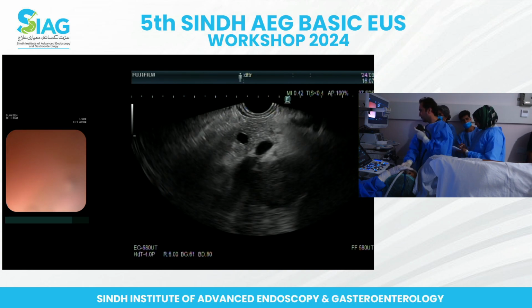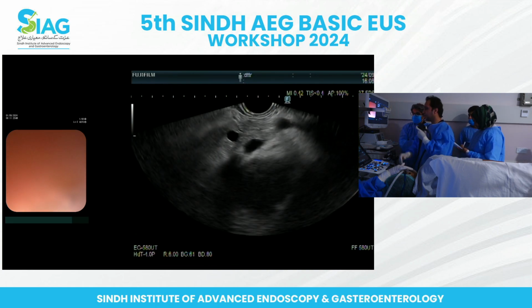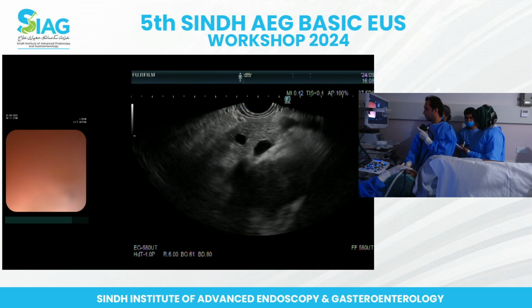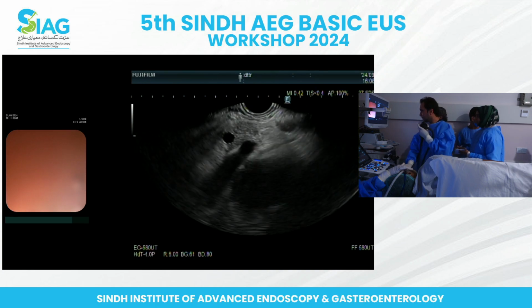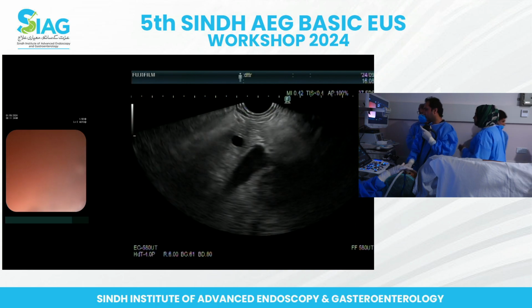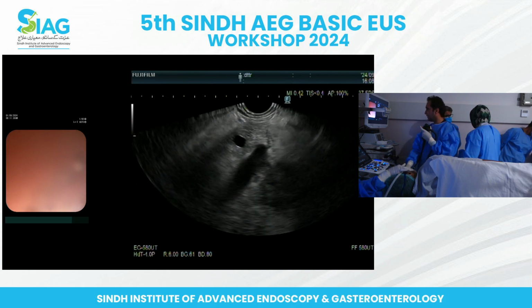Yeah? Very nice. But it's not going to be easy to biopsy from here, is it? So let's just have a look at the other end. Very nice. Sorry, what was the size of the mass? So that was 3.9 into 4, 4 into 4 centimeter.